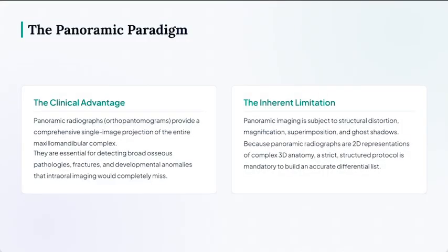So, what is the panoramic paradigm? The clinical advantage is that panoramic radiographs provide a comprehensive single image projection of the entire maxillomandibular complex, and they are essential for detecting broad osseous pathologies, fractures, and developmental anomalies that intraoral imaging would completely miss. However, the limitation is subject to structure distortion, magnification, superimposition, and ghost shadows.